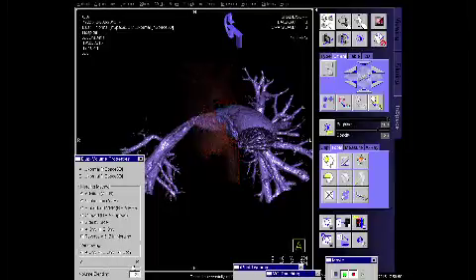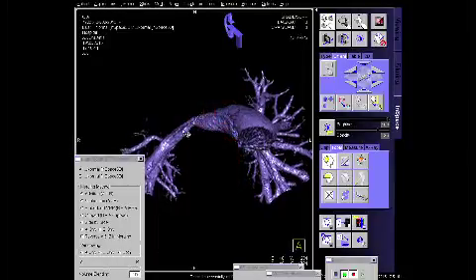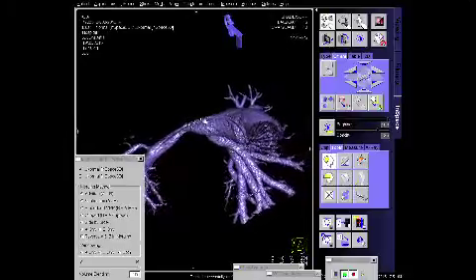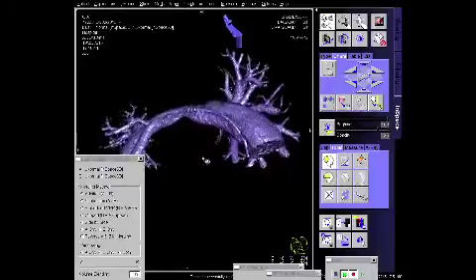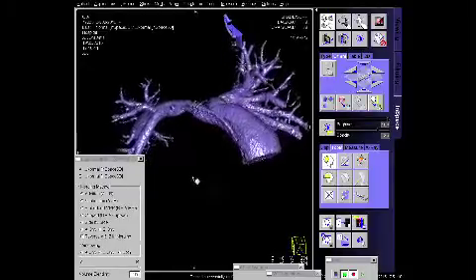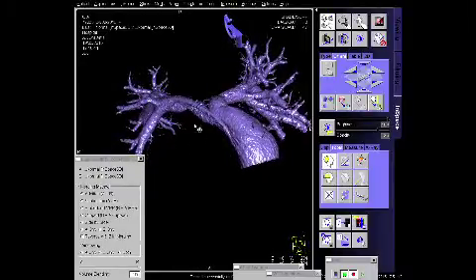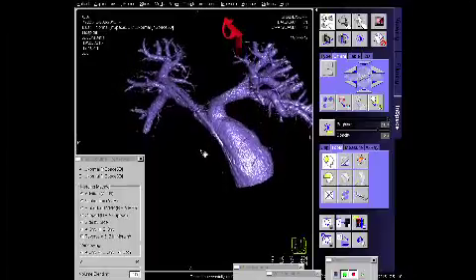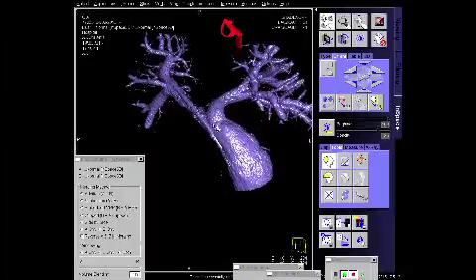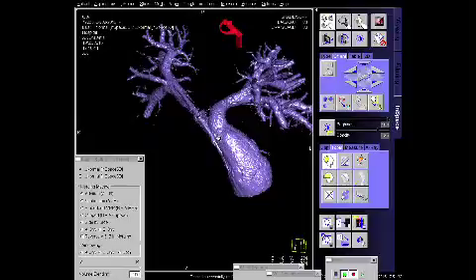If we now focus on the interventional aim, which is the RPA, LPA stent, and we blank away the aorta, on the one hand we can see the RPA stenosis, which is probably connected to the former BT shunt on the right, and we see that the wire is stretching up the RPA. Jacques, addressed to you, Jacques Reshi: of course the landmark is shifted by such a stiff guide wire, but probably it's now closer to the peri-interventional situation, so we can keep this as a good roadmap.